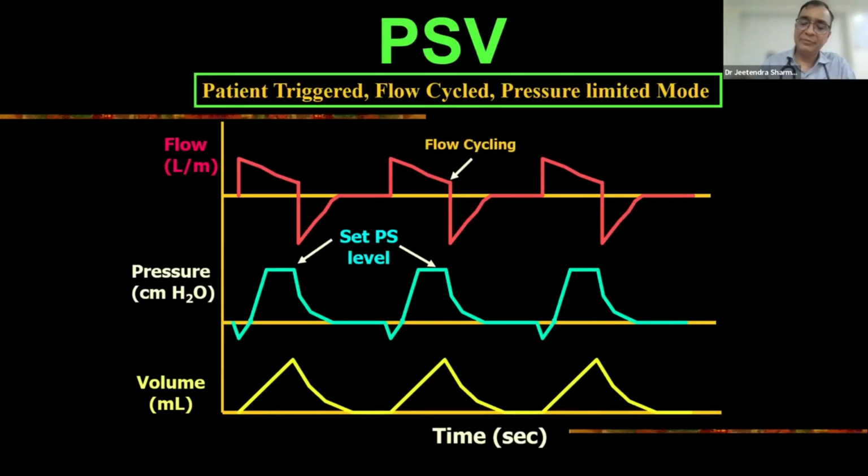Pressure support, a little bit tricky over there. Pressure control, you people understand. Triggering is time. So it is a support mode. There is no participation of the ventilator to initiate the breath. It is the patient themselves. That means the triggering is either flow or pressure. Decelerating flow, of course, this is the basic principle. All pressure preset is a decelerating flow. So that is also there.